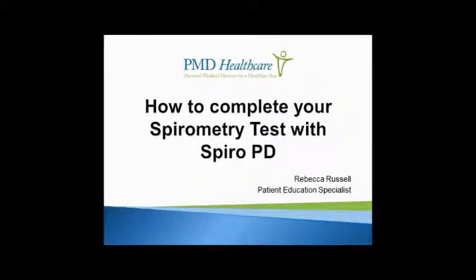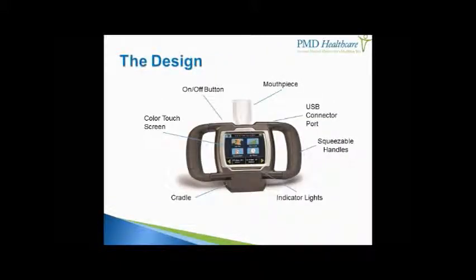Welcome to How to Complete Your Spirometry Test with Spiro PD. This is what Spiro PD looks like. Notice the on-off button at the top left, the USB connector port at the top right, and the indicator lights across the bottom.